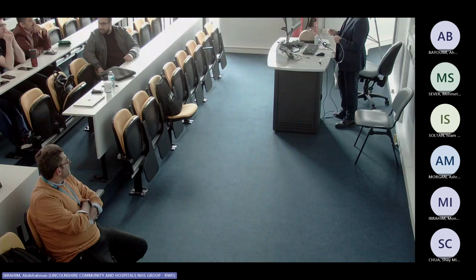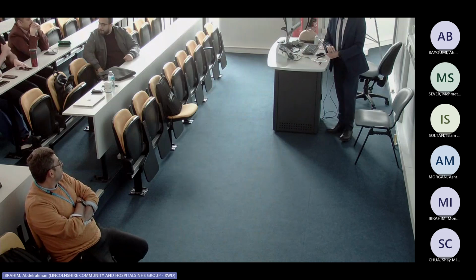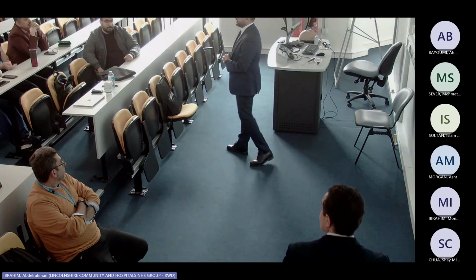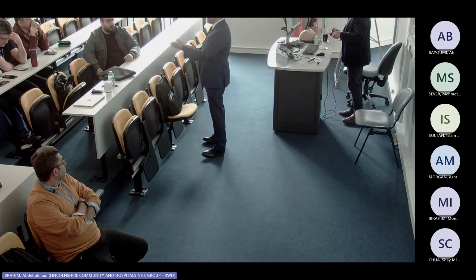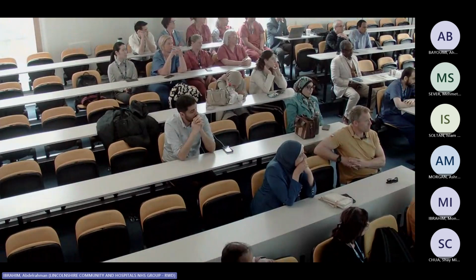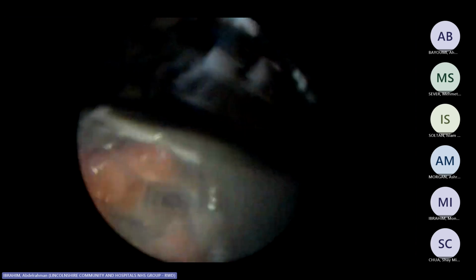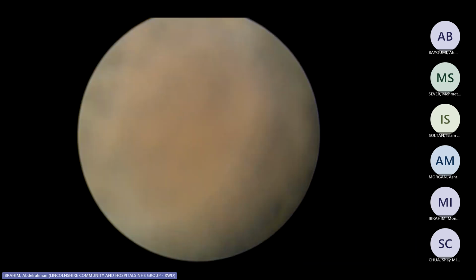Excuse me, Mr. Alam, if you have an obstructed tube, is there a danger of changing that to a patulous one? Is that a risk you need to inform the patient about? No, it's rarely. I've never seen it. Patulous eustachian tube happens when the fat starts to deplete, and it's mainly seen in patients who lose weight quickly. So it's not a risk, because the idea of a balloon dilatation is that we crush the cartilage and then it starts to fibrose and gives 1 or 2 millimeters, which is all we need. 2 or 3 millimeters to open and to allow the air to go in and out. It doesn't cause a patulous tube.